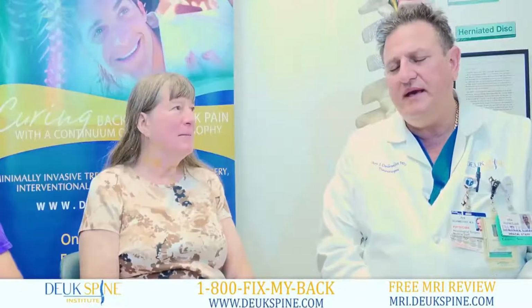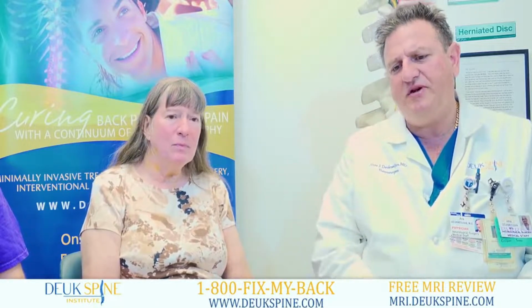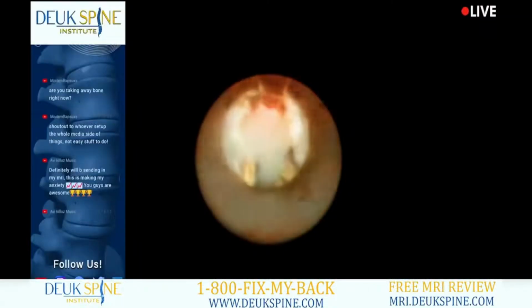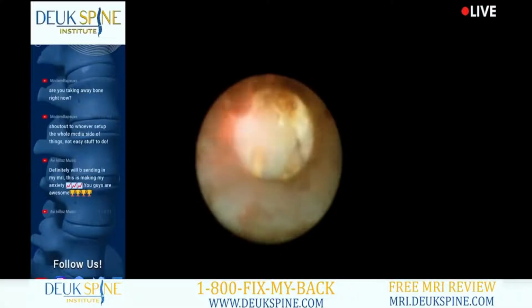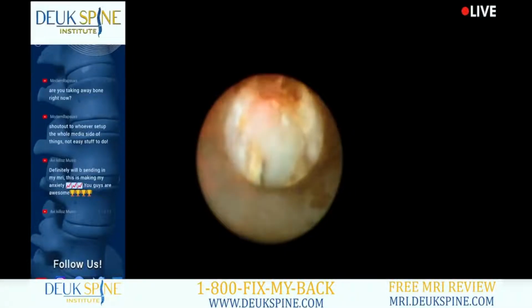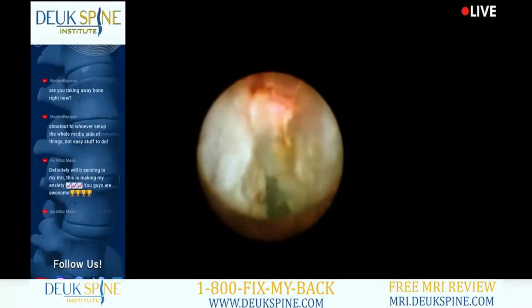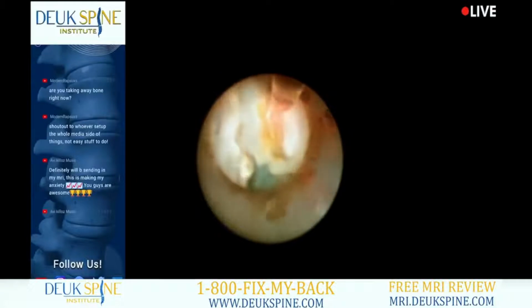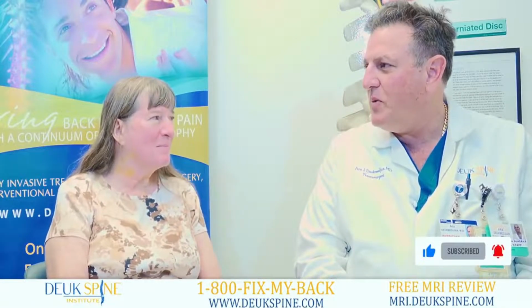Yeah, that's because she had a herniated disc, two of them, C4-5, C5-C6, and the herniations were literally sitting on the nerve, and we got in there, and if you watch this video segment right here, you can actually see there's the laser, and as we're removing the herniation, it literally pops right out of the foramen where it was sitting on top of the nerve, crushing the nerve. So the surgery was a success. We lost almost no blood at all, and you can see your incision is tiny, and here you are one day after surgery. It was outpatient, and you're ready to go home, right?